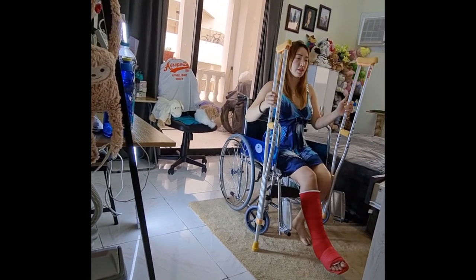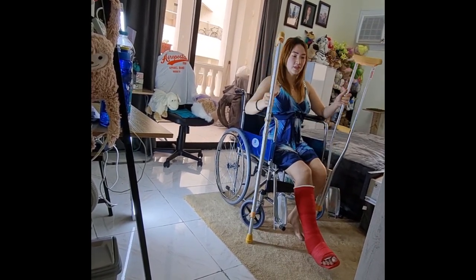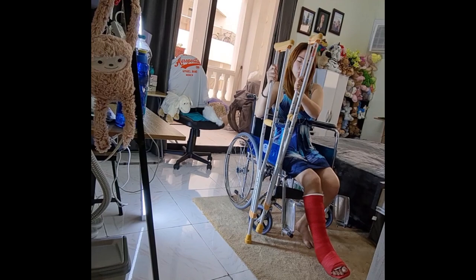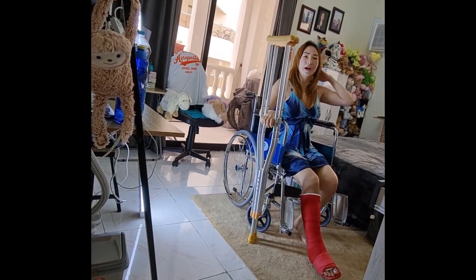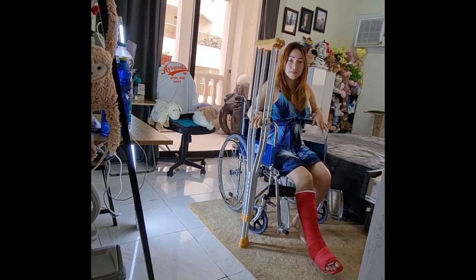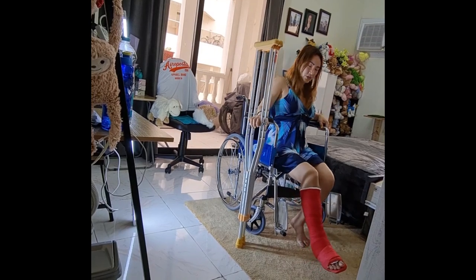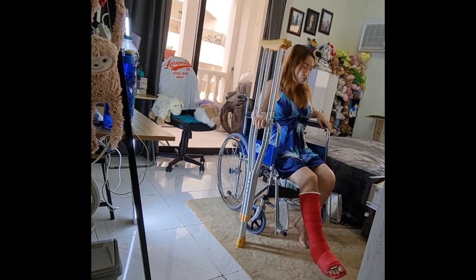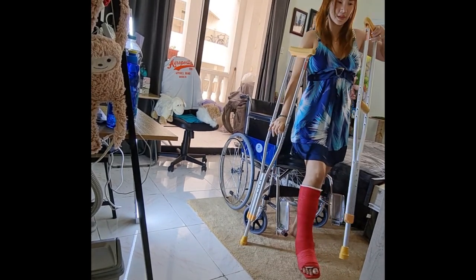If you are sitting in any corner of your house — like in bed or a chair — and the crutches are with you, you can use them like this. If you want to stand straight upward, place the crutch right beside you on the weak side, then with the good side you adjust and slide, and the strong side you push up at the same time — like that.